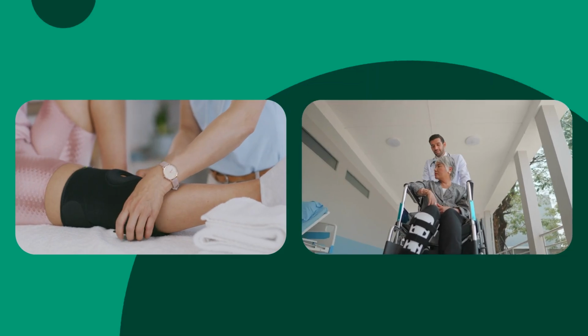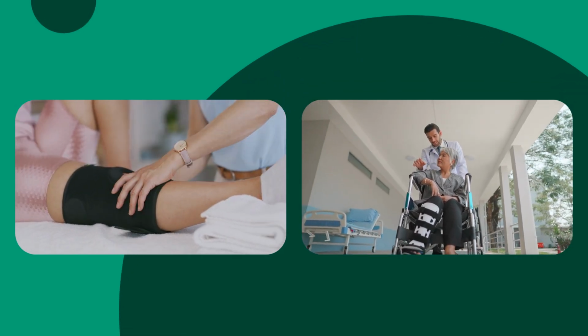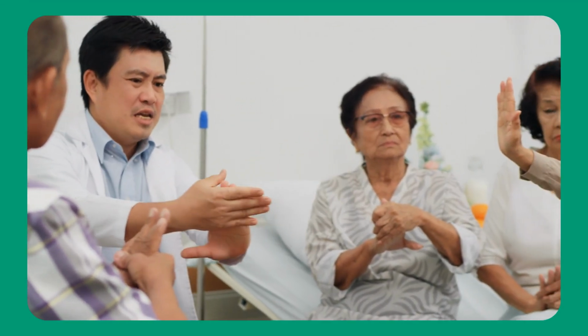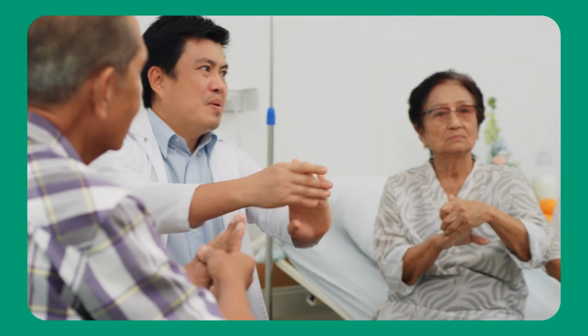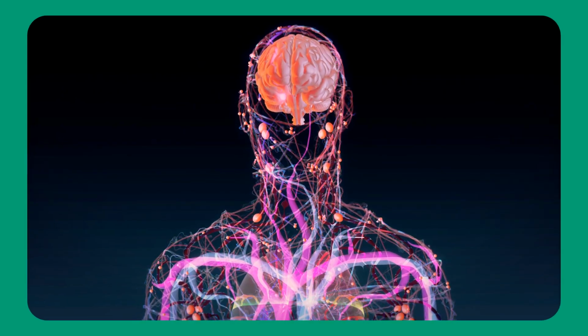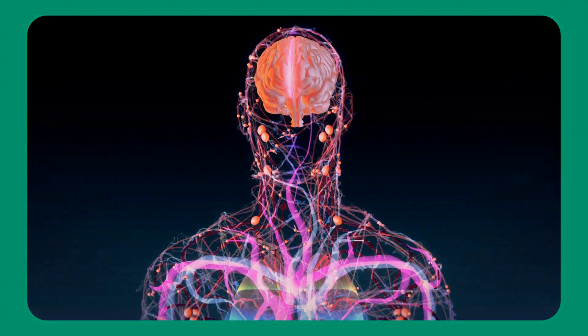Proper care is essential to prevent complications for patients wearing a splint. Always ensure proper padding at the fracture site and bony areas. Also, elevate the encased limb to help reduce swelling. Encourage active mobilization of muscles and joints, particularly fingers and toes, to maintain function and promote healing. Finally, regularly monitor for signs of nerve or vessel compression and check pressure points to ensure the splint isn't causing further issues.